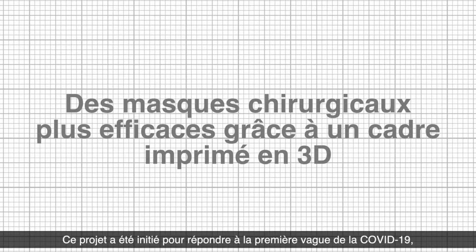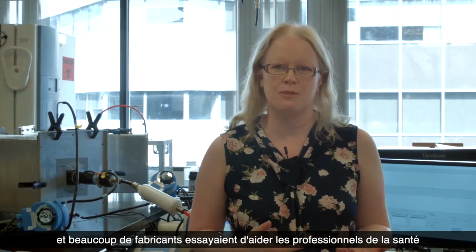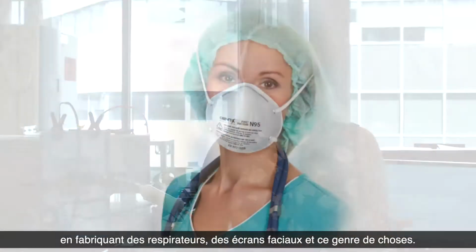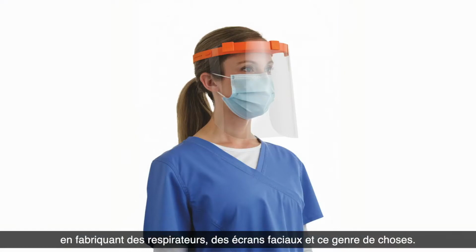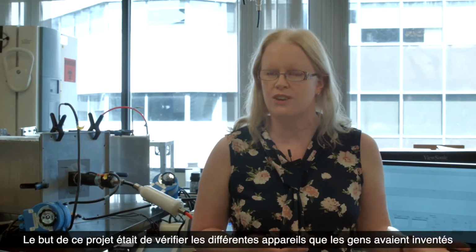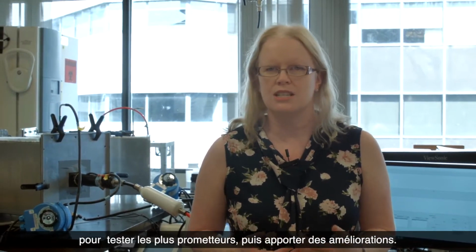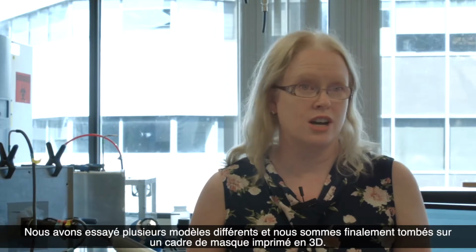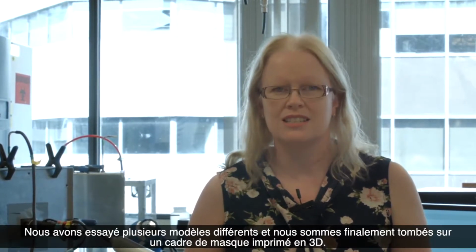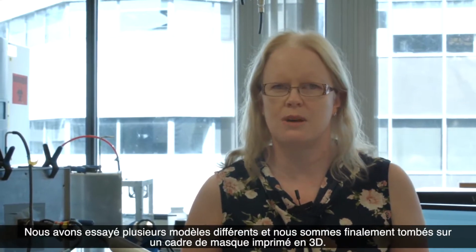This project was initiated in response to the first wave of COVID-19 when there were shortages of PPE. And a lot of makers were trying to help medical professionals by making respirators and face shields and that kind of thing. The goal of this project was to look through the various devices that people had come up with, to test the most promising ones, and then to make improvements. We tried multiple different designs, and we eventually came across a 3D printed mask frame.